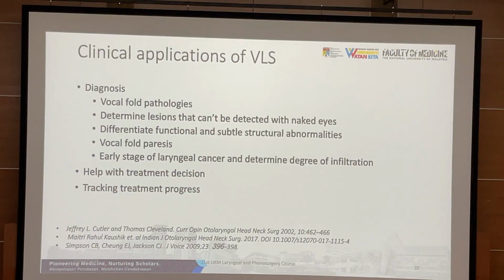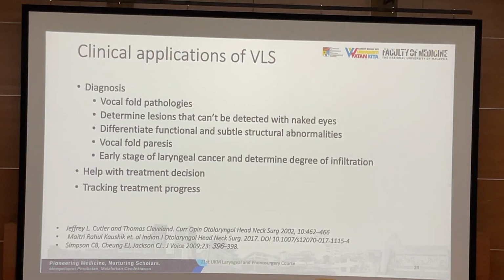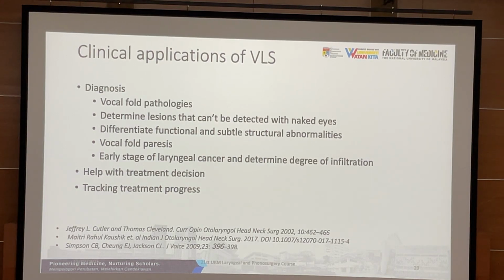So these are the clinical applications, the list. Vocal fold pathologies. Do we need a stroboscopy to diagnose a huge vocal polyp, like Ms. Nadira showed just now? You don't need a stroboscopy to diagnose a vocal polyp.